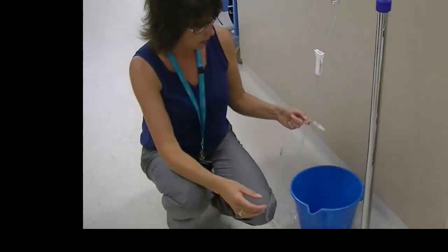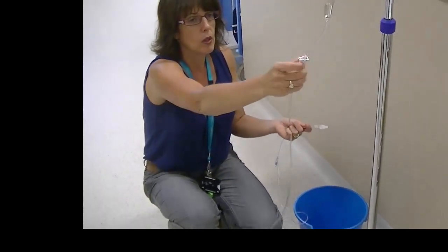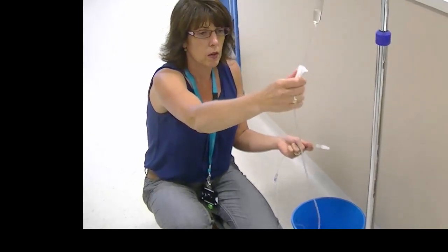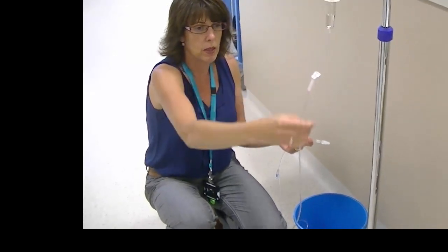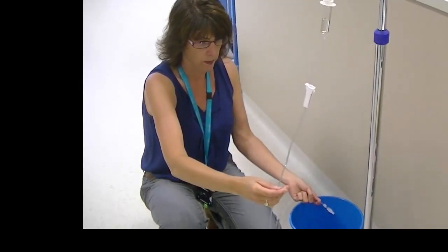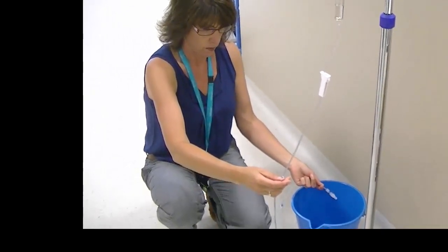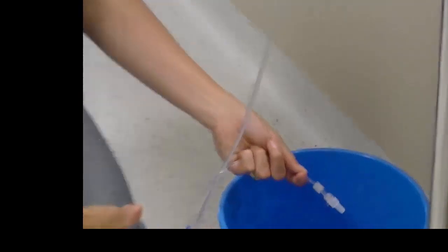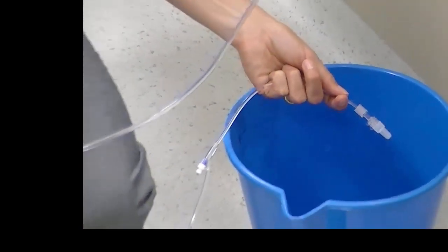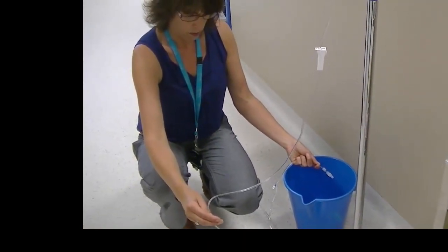Okay, it's to the end. Notice I did not take the cap off. There's no need to take that cap off. If you take the cap off, you potentially can contaminate. I've got a little bubble, so I'll just keep it running for a minute, just to get that bubble out. Be patient.